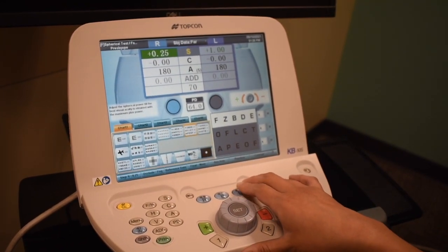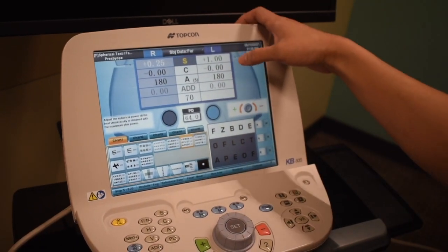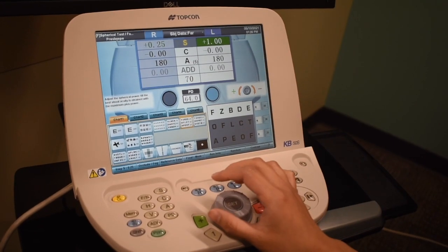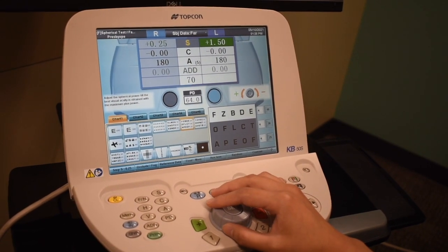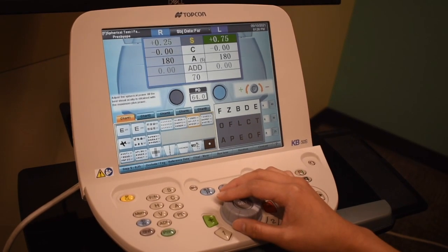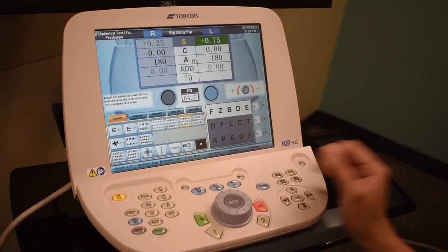Now we're going to go ahead and move on to his left eye. This eye will be blurred for him, but we're just going to double check that he is properly blurred to the 2040 line. Can you make out any of those letters there? I'm just going to add a little more plus here. Tell me when you can see one or two of those letters. Two — F and Z again.